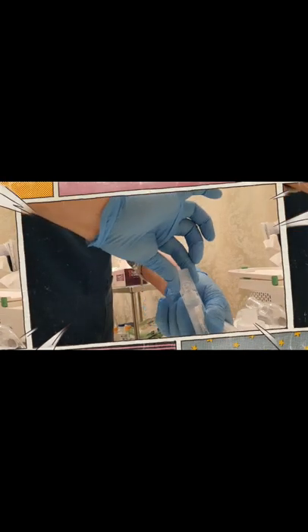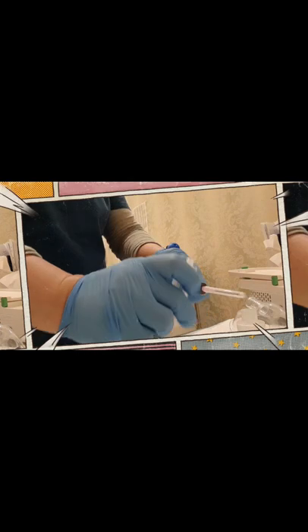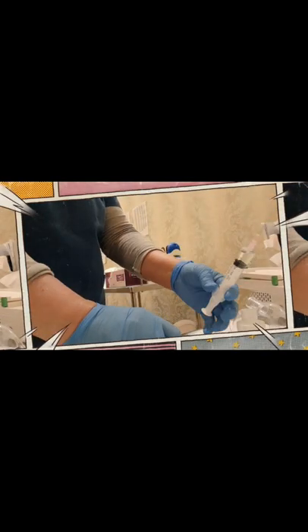Now you need to have a syringe with a needle to measure the correct amount of medicine required according to the prescription. Open your normal saline container and measure 2.5 cc of normal saline, then put the saline inside the medicine bottle.